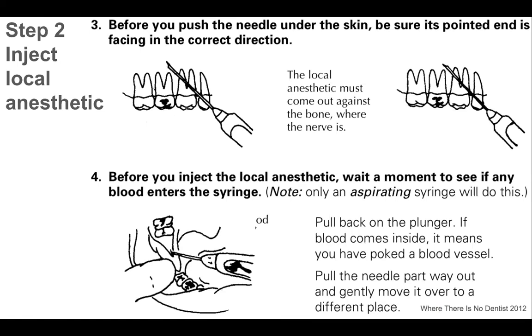Before you push the needle under the skin, be sure that its pointed end is facing in the correct direction. This pointed end is facing the tooth you want to remove, not away from the tooth.